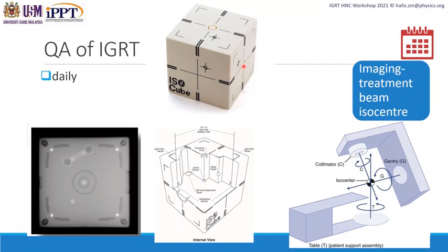When you position this cube according to the laser position, the radio-opaque marker should be at the center of the treatment.